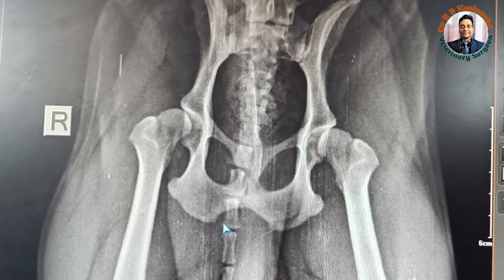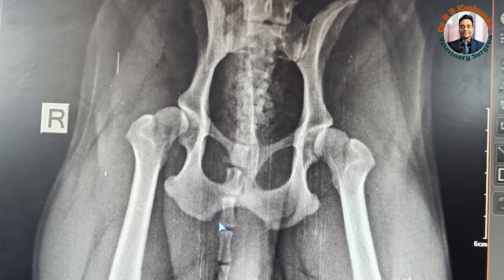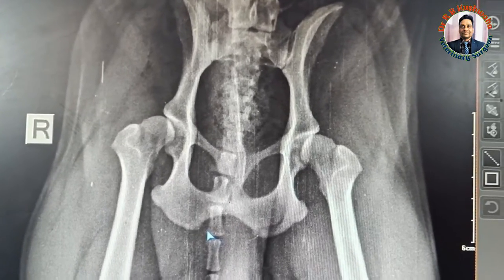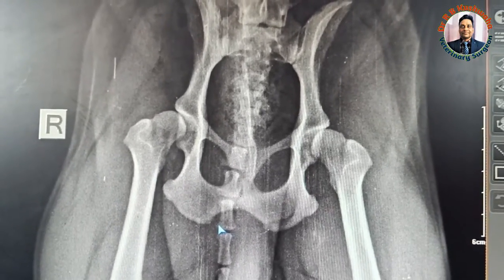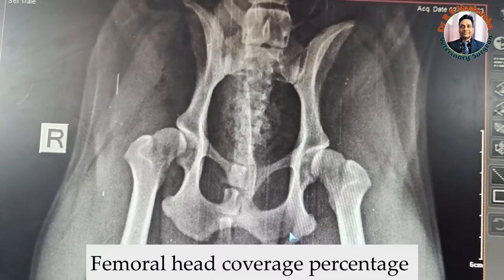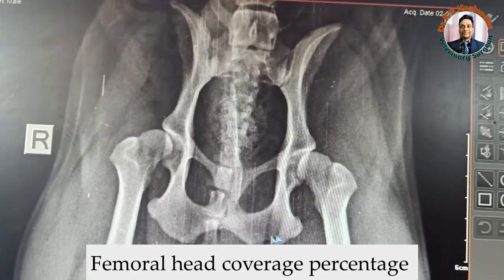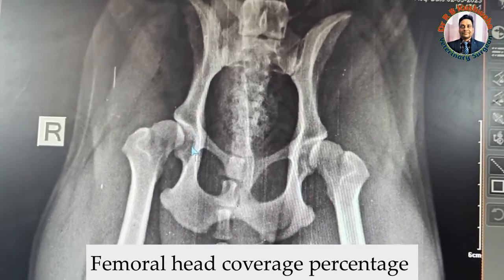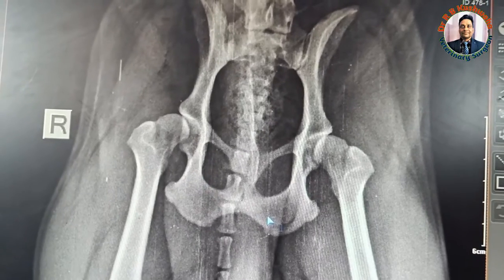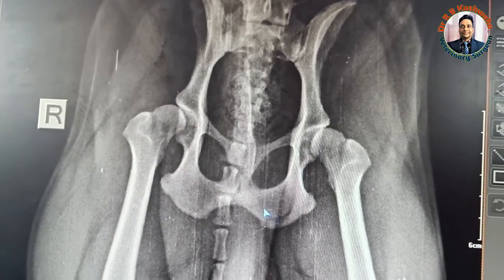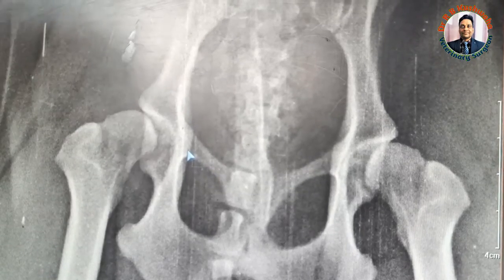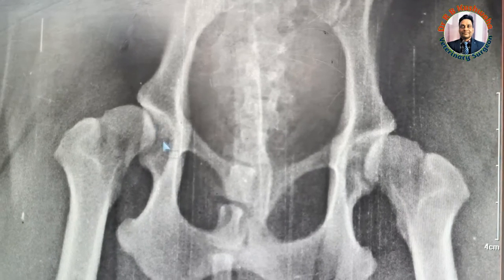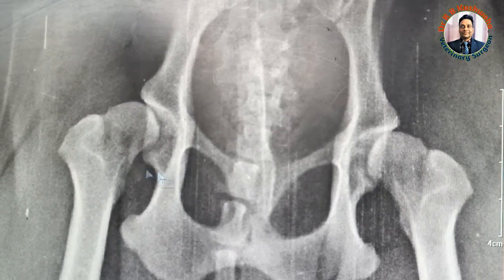There are certain other radiographic parameters for further confirmation. You can go for the femoral head coverage percentage — meaning how much of the femoral head is covered by the acetabulum. Normally it should be covered 60%.